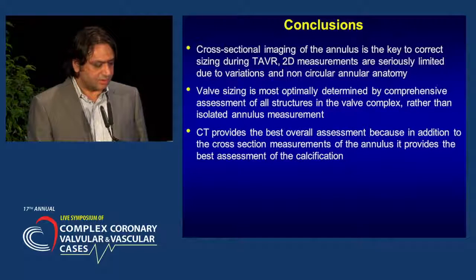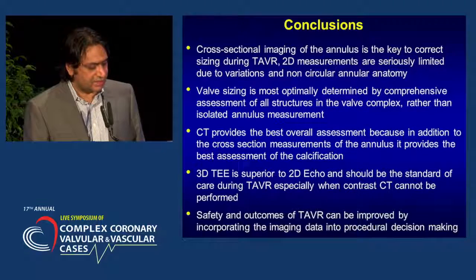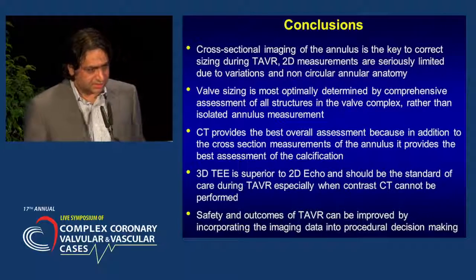CT provides the best overall assessment because in addition to the cross-sectional measurements of the annulus, it provides the best assessment of the calcification. 3D TE is superior to 2D echo and should be the standard of care during TAVR, and safety and outcomes of TAVR can be improved by incorporating these imaging modalities.